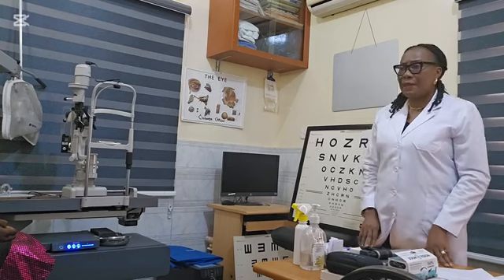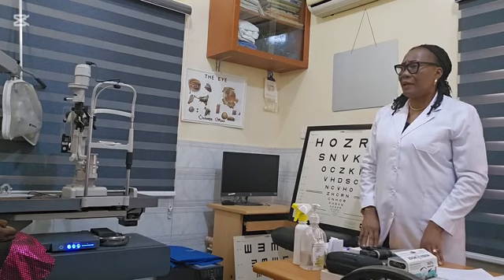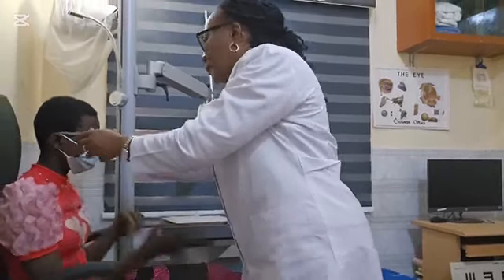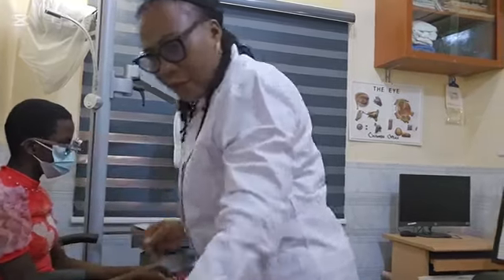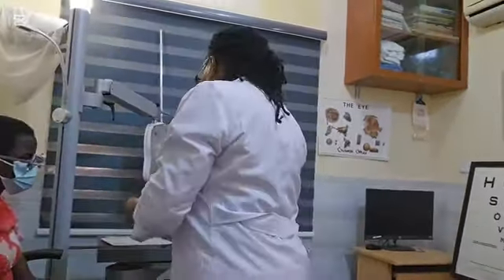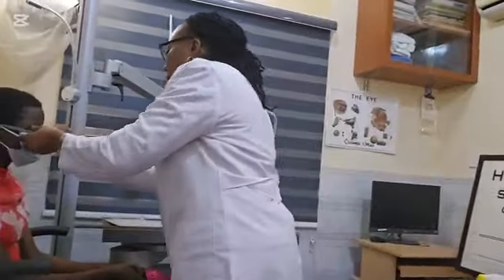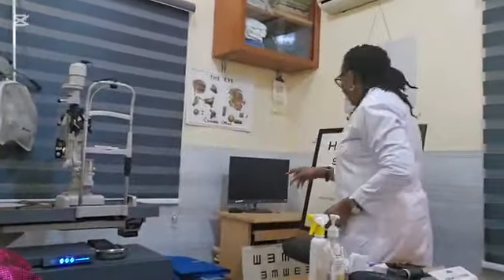Okay, so let's first check her visual acuity, first at distance and at near. We are going to do that monocularly and then binocularly. So please, can you read? Yes. Go ahead.